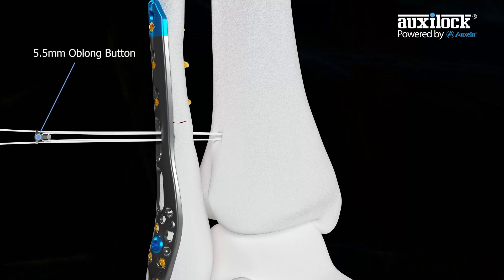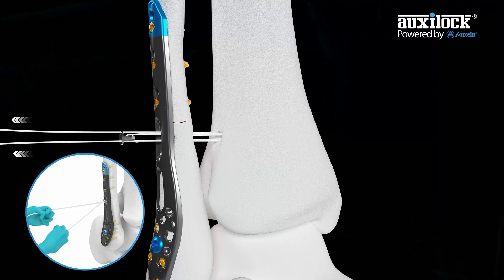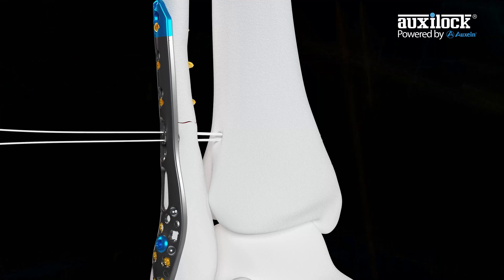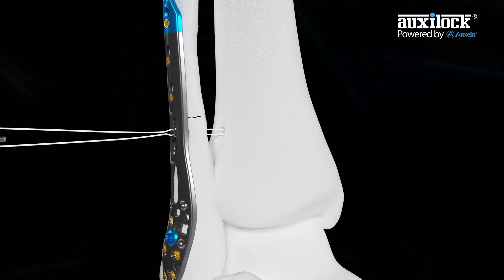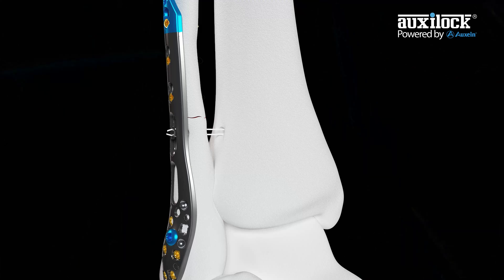Grasp the center sutures of the oblong button before tensioning. Slide the oblong button down to the plate or bone, pull the sutures straight back one at a time in the direction of the suture toward the surgeon. The lateral button will sit flush. Cut the white suture tails flush with the oblong button, ensuring the sutures on the lateral oblong button are not damaged while cutting.